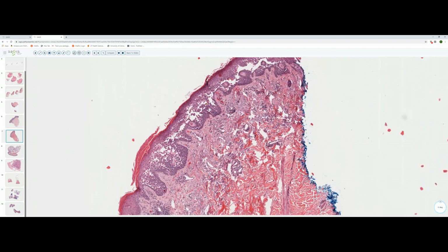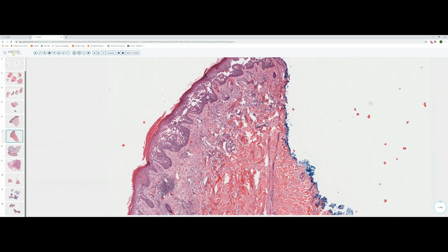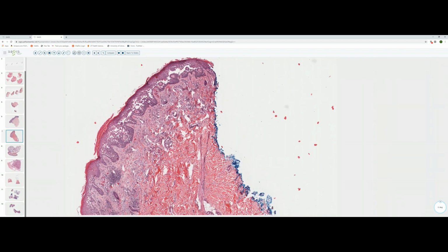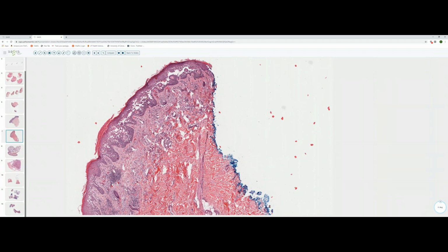The thing to keep in mind is that while Hailey-Hailey and pemphigus, like Grover's and Darier's, have acantholysis, Hailey-Hailey and pemphigus do not have an appreciable amount of dyskeratosis. So if you see FAD, where you've got pronounced acantholysis and dyskeratosis, you can pretty much exclude pemphigus or Hailey-Hailey in the differential diagnosis.